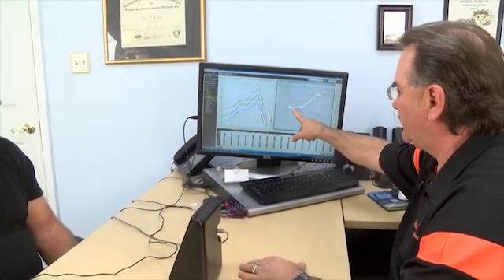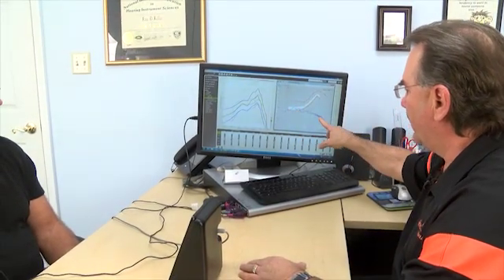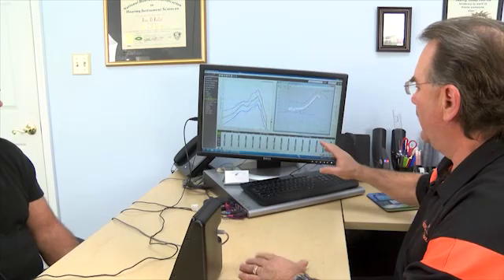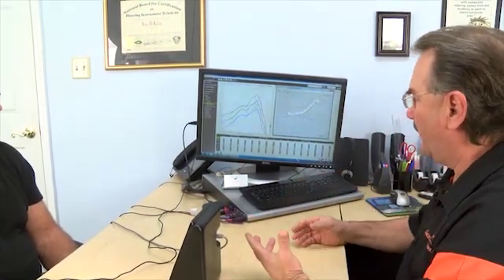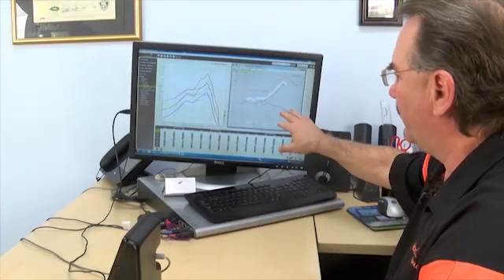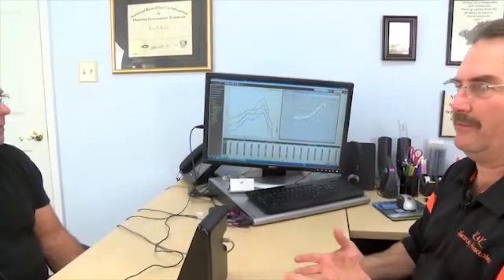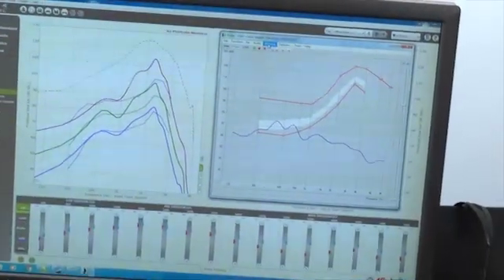You can see this line here is reading what's going on in his ear, which is very little. He's getting some low pitch help here, but his high frequencies are doing nothing. Now that's what happens when a person basically has a hearing loss and they're not getting the proper stimulus. So these high frequencies are not up here. So that means that information is not getting to the brain.